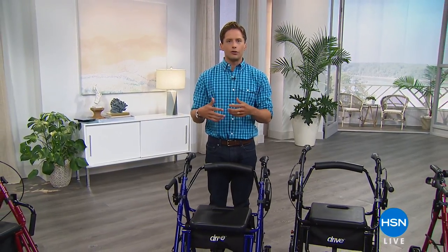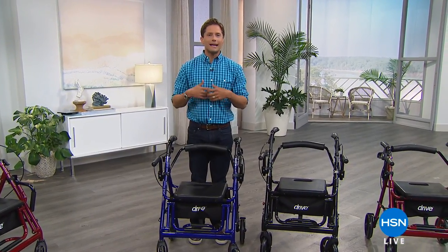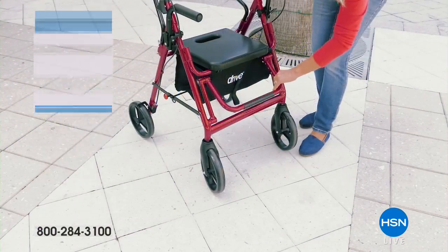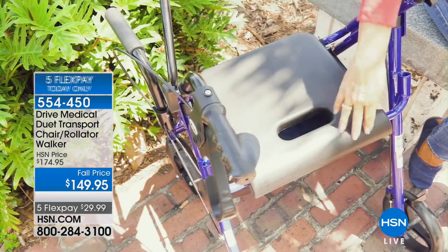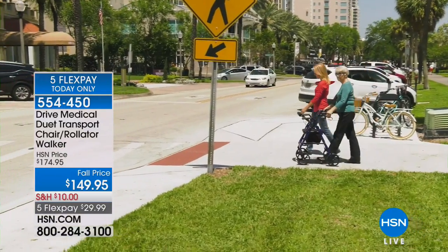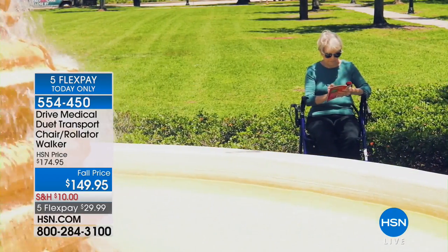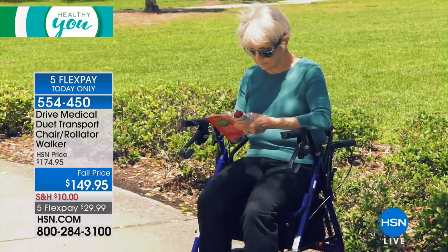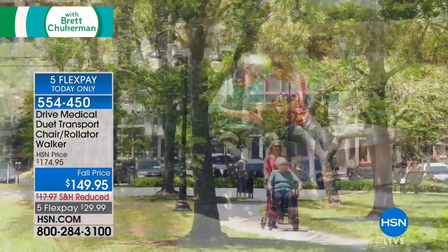Welcome back to Healthy You. My name is Brett Chuckerman, and this week's show is about solving your health problems, getting you living your best life by feeling better, being active, and engaging in the world. The research has been done: as you get older, the most important thing to living a longer life and staying as healthy as possible is getting out of your house, interacting with nature, and interacting with people around you. Every time I look at similar products on the market, none of them have the amount of features, comfort, stability, and mobility as our Drive Medical Duet.